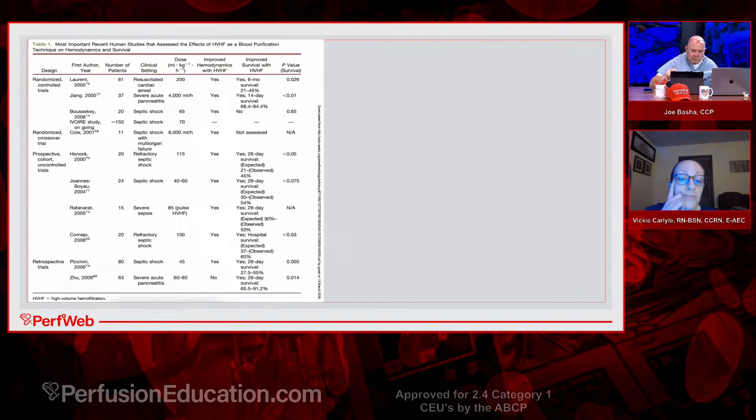No, everything would probably come out like 18 or 19 on the dosing, which is just ridiculous for HDF. And I'm with you. I bang my head against the wall because HDF in particular is frustrating. It's two different modes. That doesn't mean to halve the dosage on each mode and still come out with one therapy. You're just doing half the dosage on each therapy.